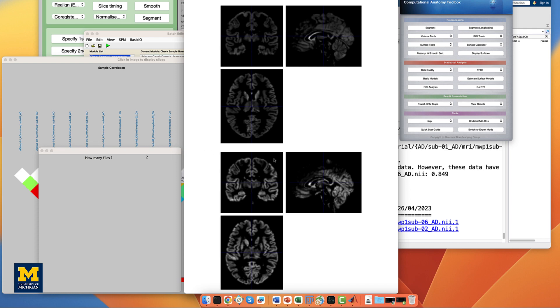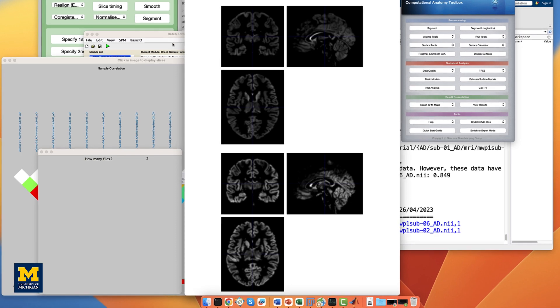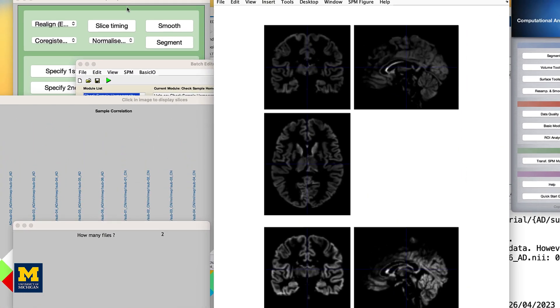The last preprocessing step is to smooth the data, which, similar to fMRI data, will average together signal and cancel out noise. Since we are focusing on volumetric data, we will use a similar smoothing kernel to those used in fMRI data. From the SPM12 GUI, click on Smooth.